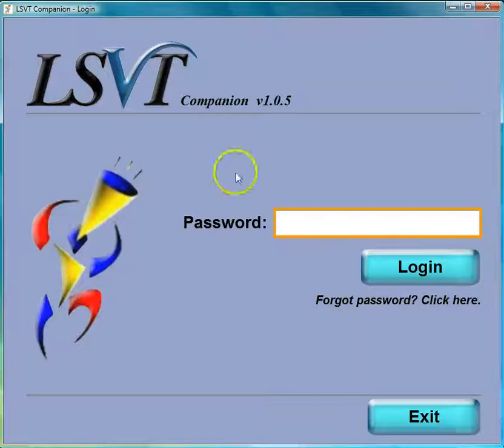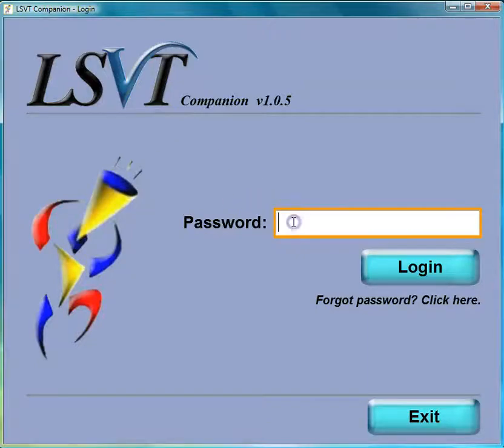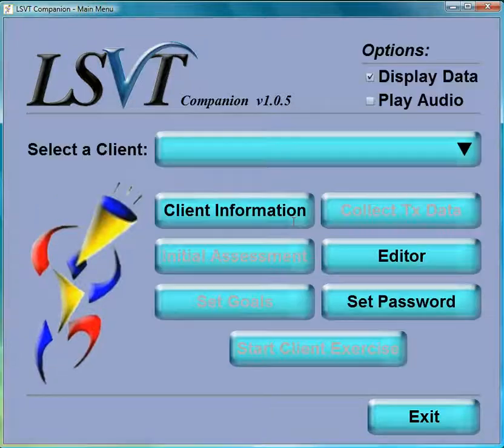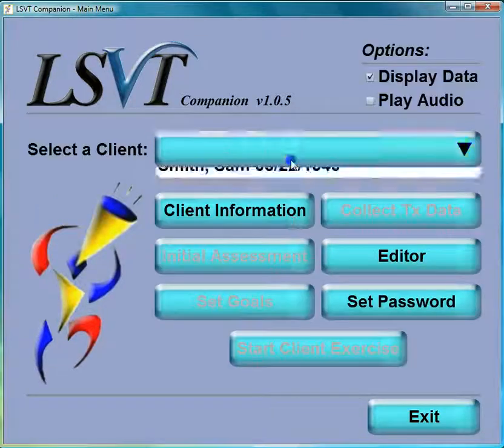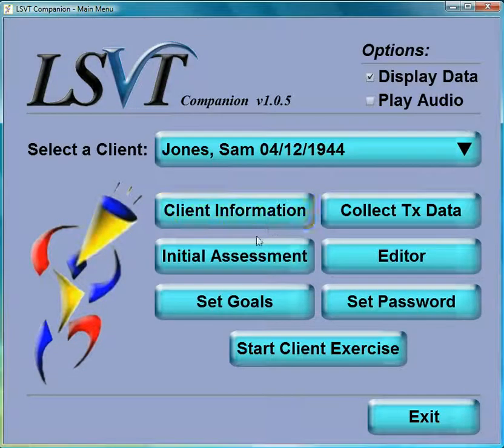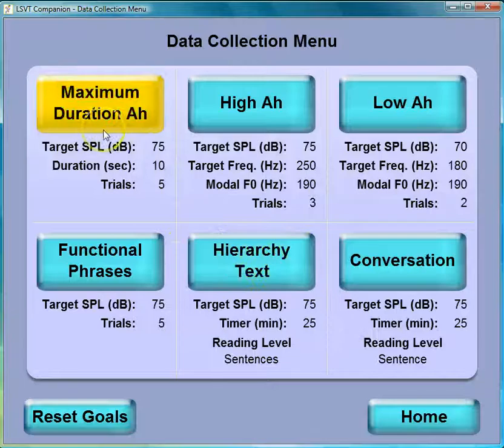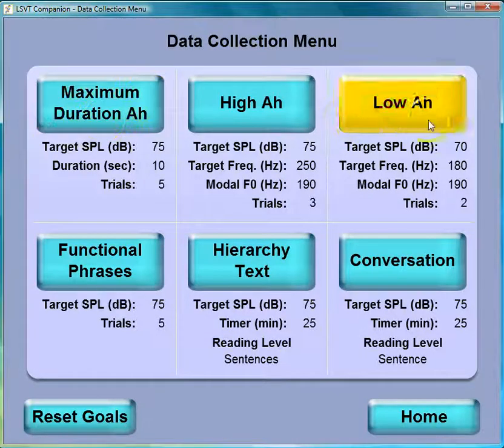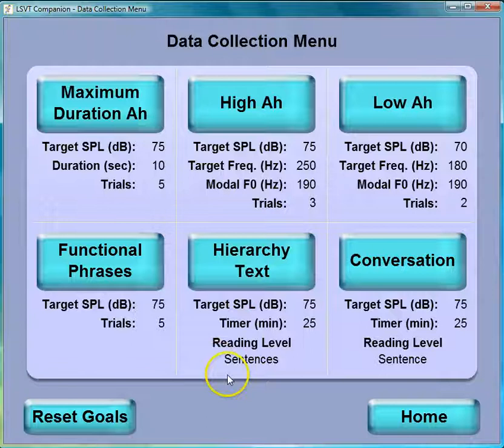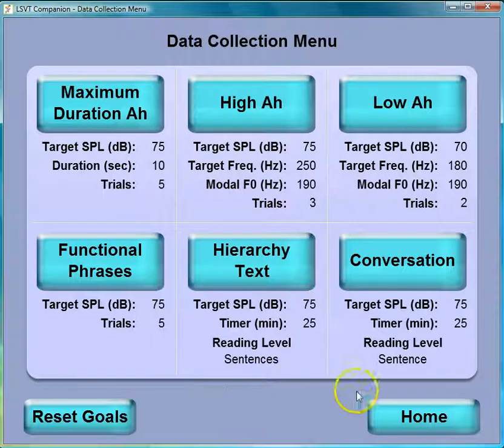Once you launch the program, you'll need to type in your password and log in. In this session, you can select your client, collect your treatment data, and go through the process of your exercises — the high, low, etc. You can see the other tutorials to learn more about how that's done.